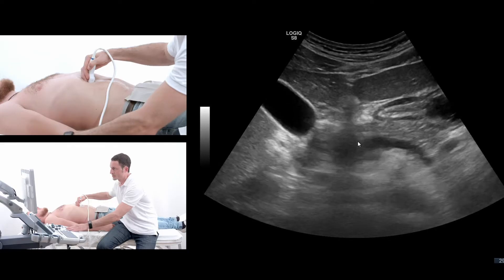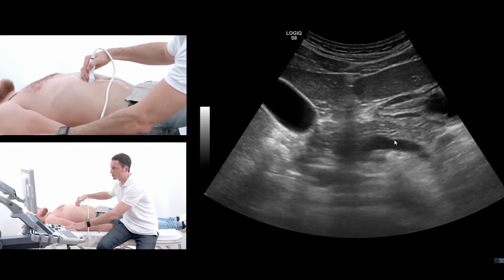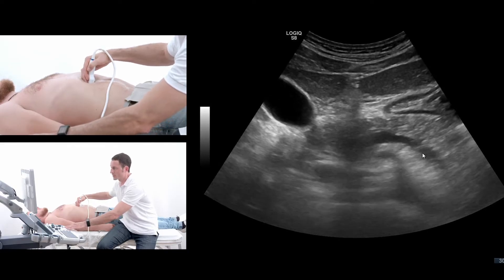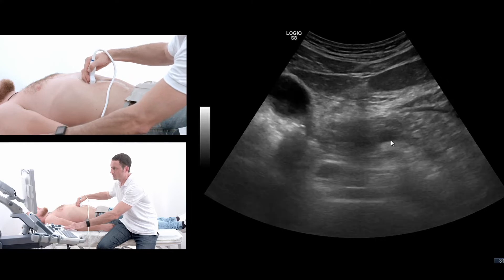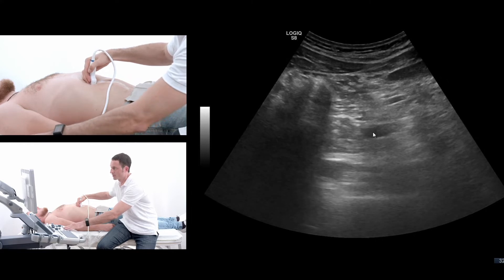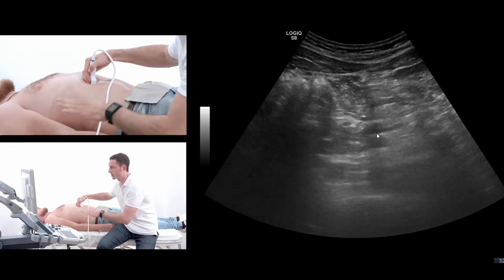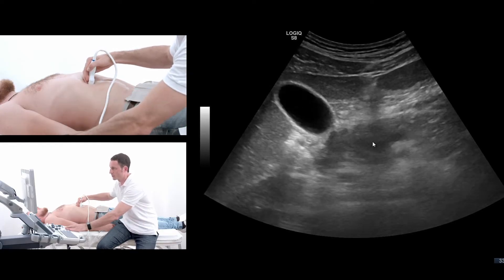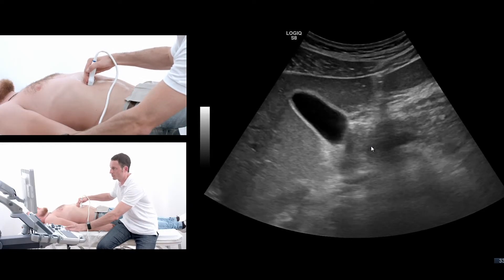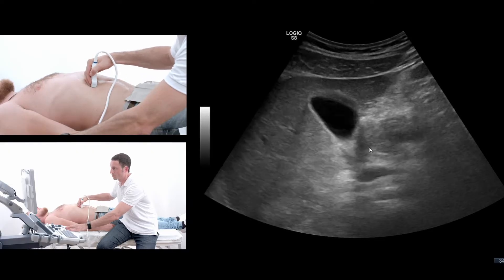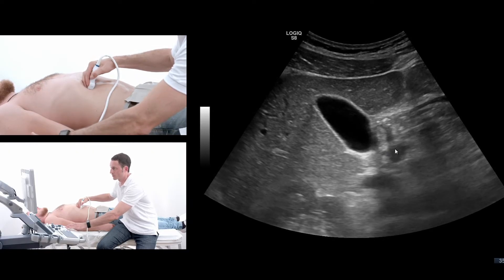As a leading structure for the pancreas, always use the splenic vein coming in from the back to join the mesenteric vein coming from the caudal part of the body to produce the portal vein in the center of the liver.